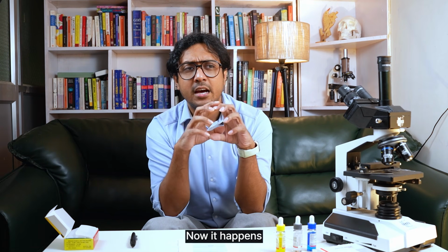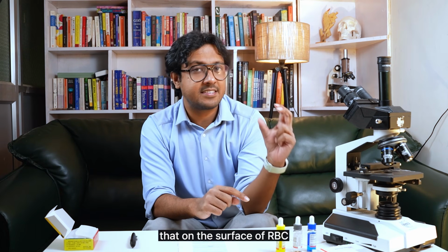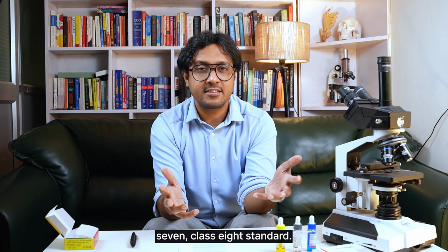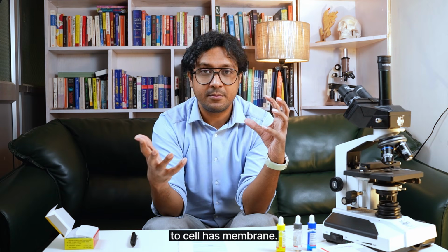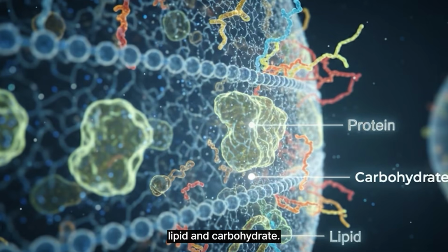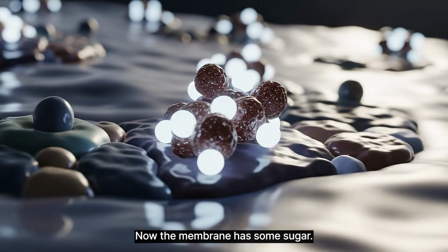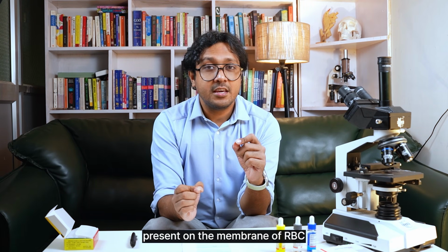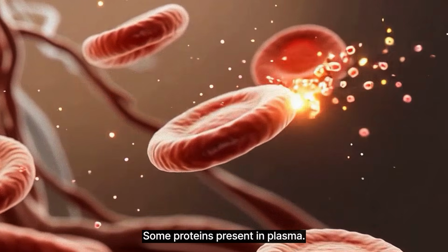Now it happens on the surface of the RBC, the red blood cell, which you all know maybe from class 7, class 8 standard. The cell has a membrane made up of protein, lipid and carbohydrate. Now the membrane has some sugar, and those sugar molecules present on the membrane of the RBC can react with some protein present in plasma.